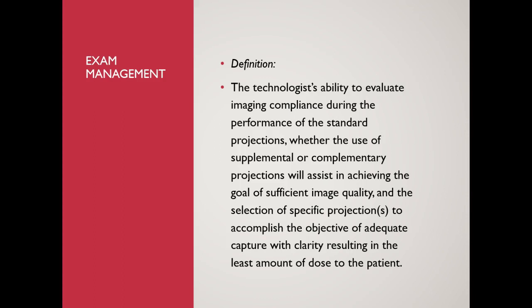So we're going to go back to something we learned in a prior chapter, and that's exam management. And here's the definition. It's the technologist's ability to evaluate the imaging compliance during the performance of the standard views, whether the use of supplemental or complementary projections will assist in achieving the end goal, which is sufficient image quality.